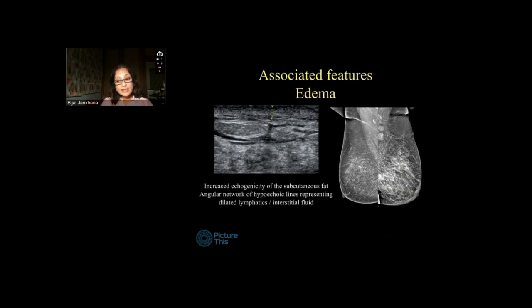The causes of skin edema could be infection, as well as inflammatory breast cancer, mastitis, even congestive heart failure. Sometimes even following surgery and radiation, we may see some amount of skin thickening and edema.